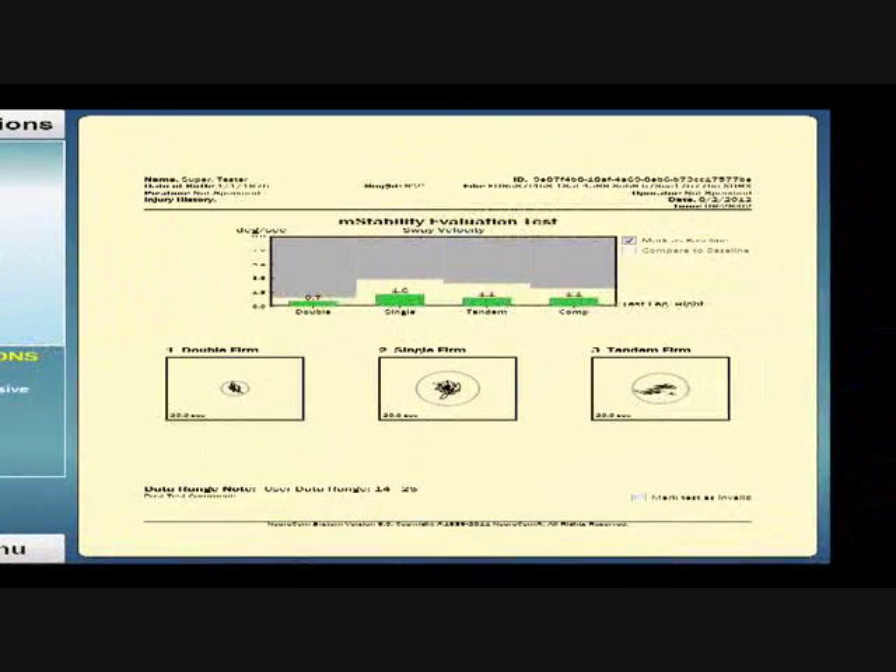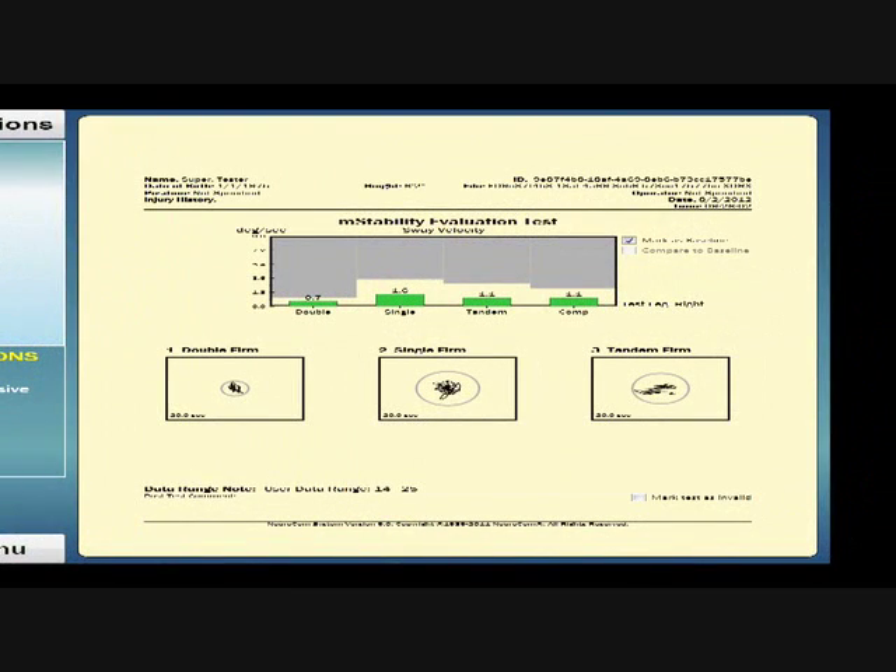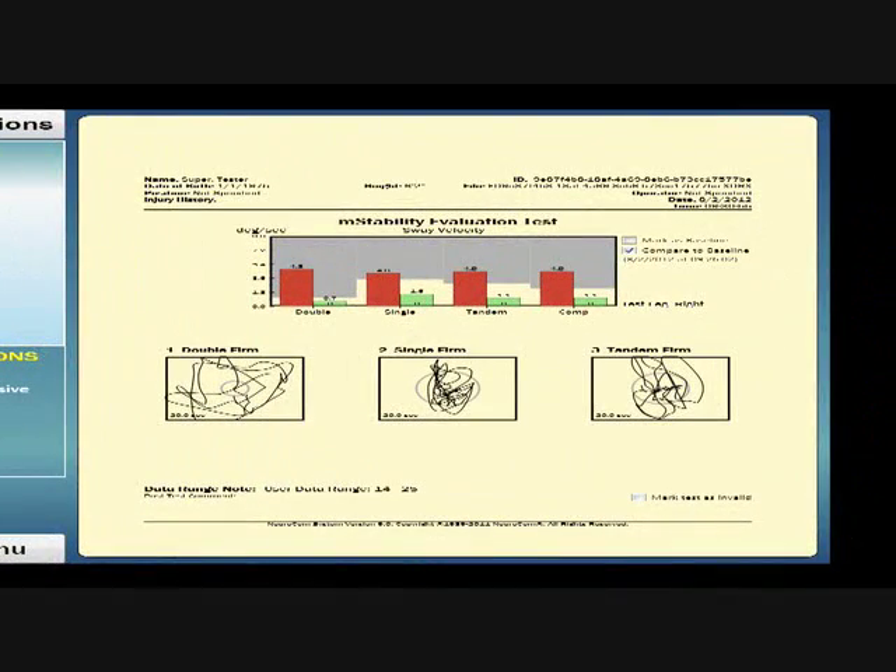We're looking here on the computer — these are the results of the test that we just did with you. These scores indicate your baseline from the first test we did; you can see very low sway or movement. The taller boxes over here indicate the test done after your head injury, and you can see your sway or movement is still within the parameters, but much higher than your baseline.